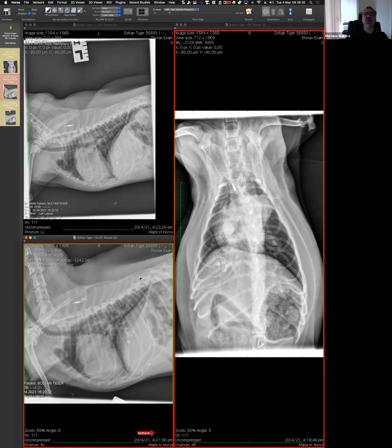So the atrioventricular, the tricuspid or the mitral? No, the tricuspid, the right-sided valve. Okay. But so that, I think, is a good idea, and in this case may end up having that. But I don't think that can explain the changes in the pulmonary arteries. It wouldn't, sorry, I'm getting confused here. So anything causing decreased compliance, or anything that reduces the lung capacity to expand, so any other kind of blockages.